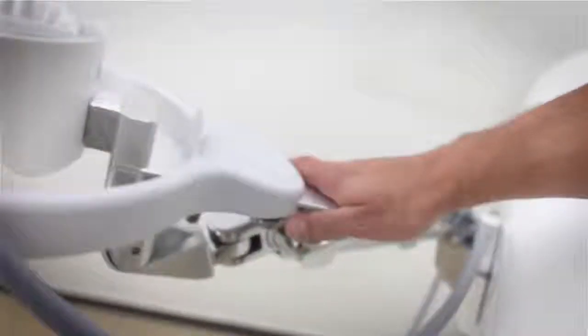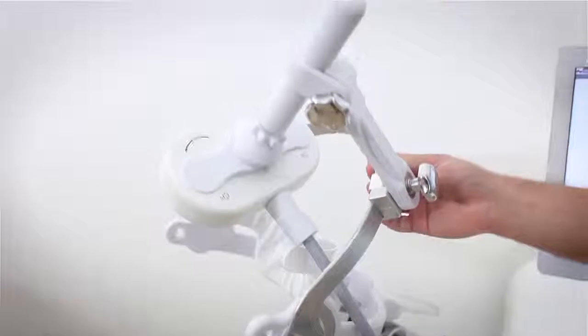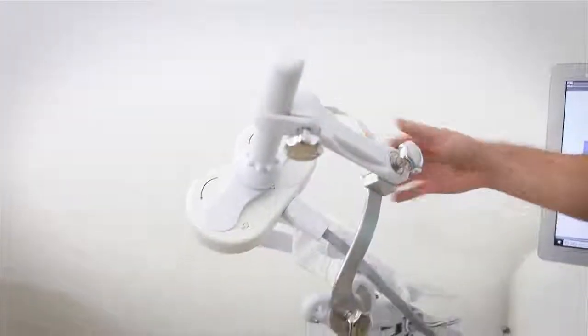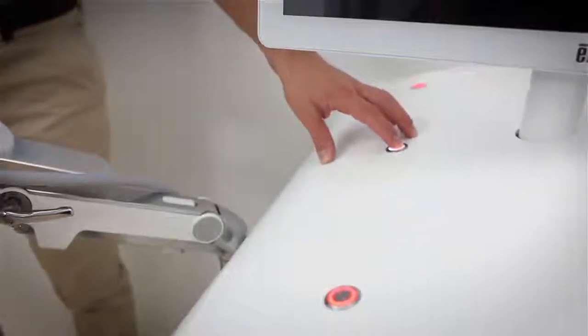The head and neck support called HANS ensures accurate stimulation and has the unique ability for the coil to follow a patient's head movement.